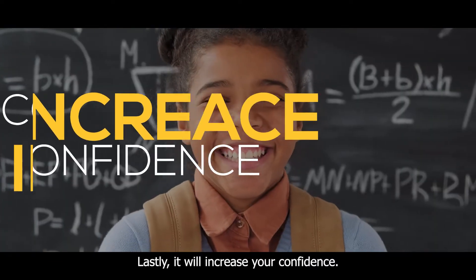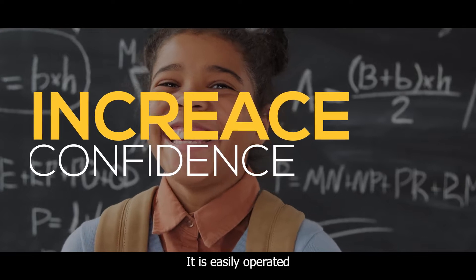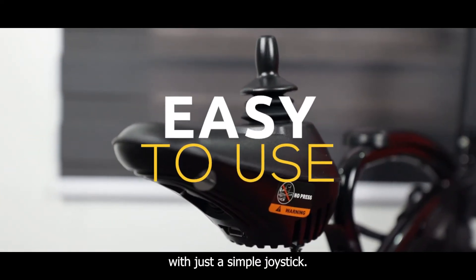Lastly, it will increase your confidence. It is easily operated with just a simple joystick.